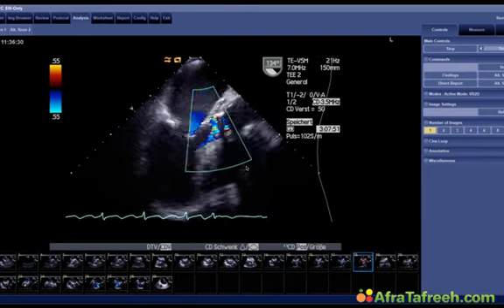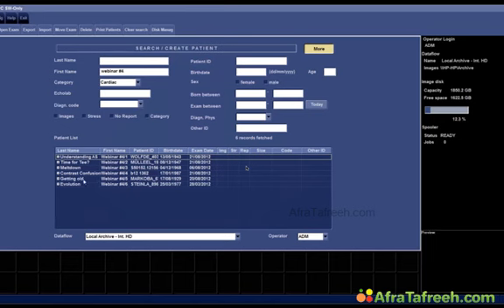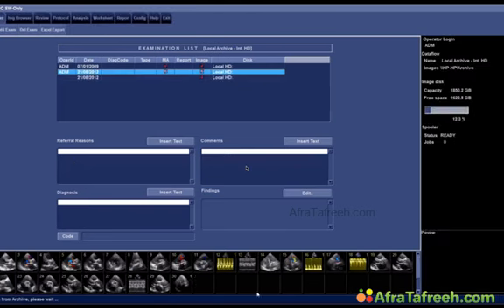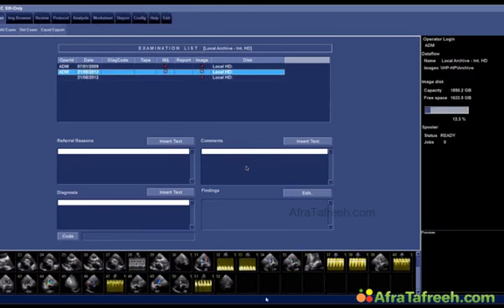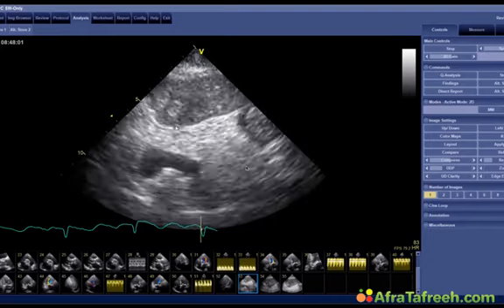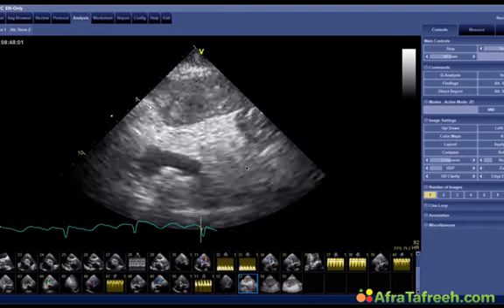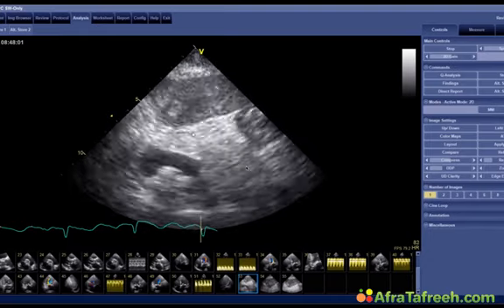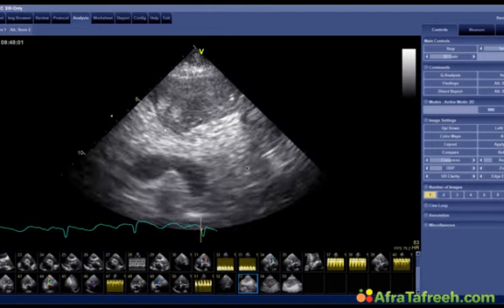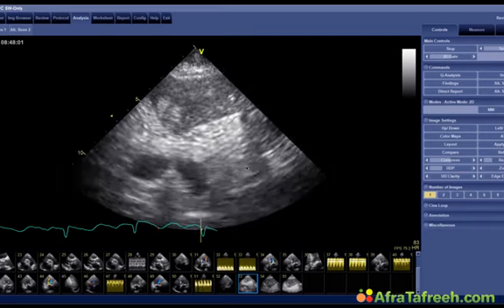The only problem in this patient is, and I'll show you this patient again from the transthoracic approach. Okay, the only problem we have is, I put the transducer also to the liver, and this is what I found here. Now, this is a very obvious finding of tumor in the liver, and the patient has a hepatocellular carcinoma of the liver, and she's under chemotherapy.